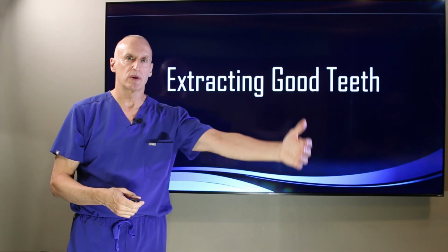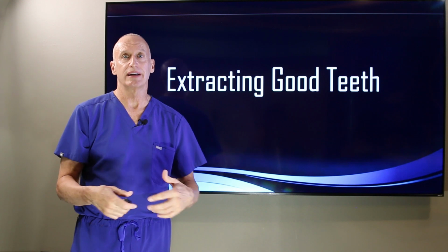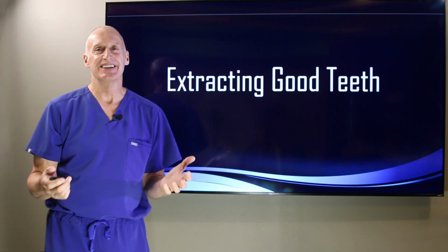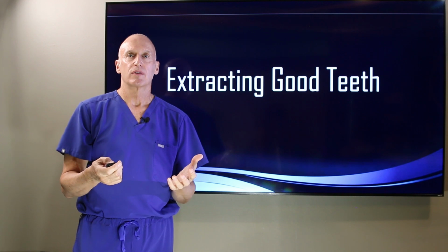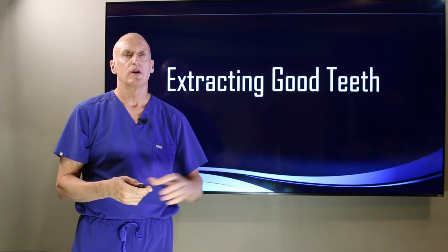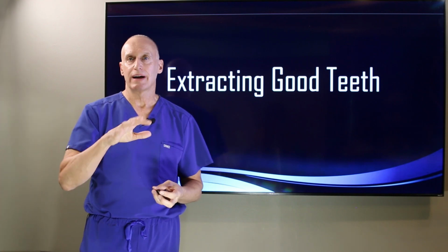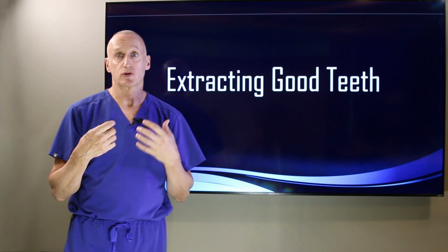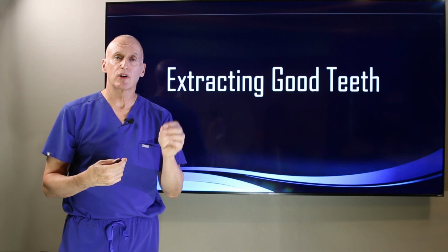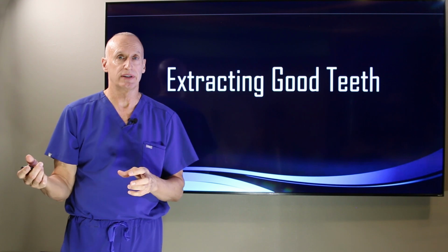So let's fast forward 10 years, and let's say that some or all of those teeth are now ready to cross the rainbow bridge. And now what do we do? We're going to ask that patient to pay tens of thousands of dollars more to fix their mouth a second time. So the way I phrase it with my patients, which I think is super fair, is that I would like to be informed the same way: if you can only do this once, then we should err on the side of taking your teeth out.